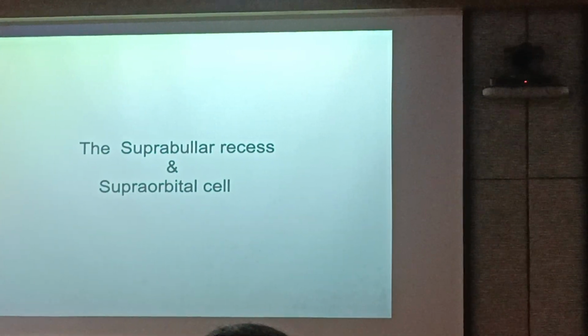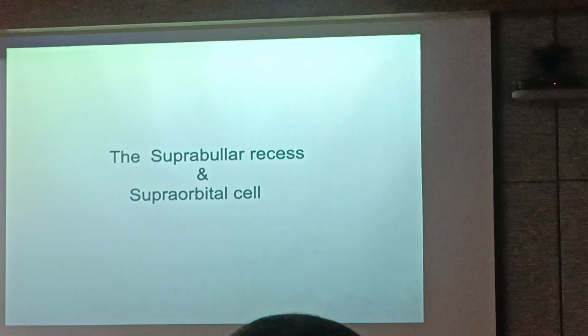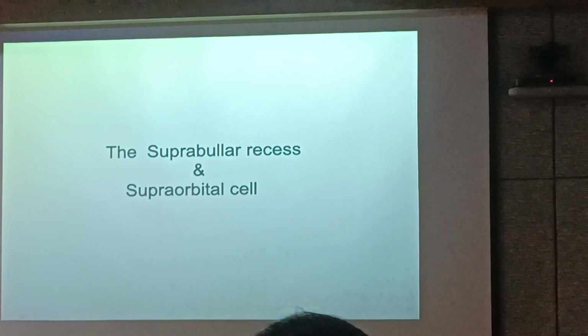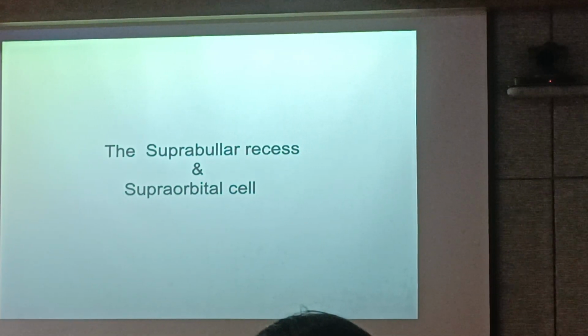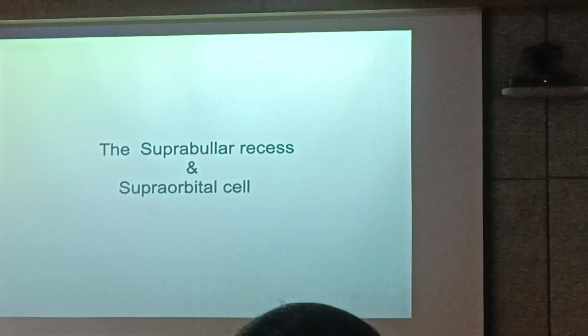Yes. Yeah, so I'm going to show you. I'll show you how the frontal sinus does not necessarily mean every time that you will remove the upper part of the uncinate. We'll come to that.